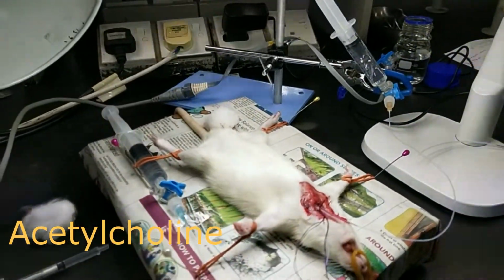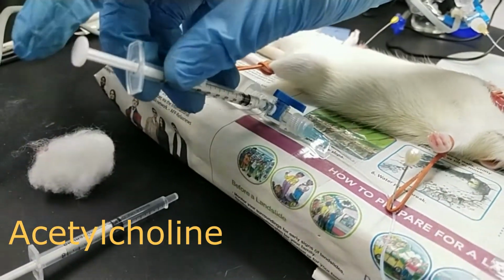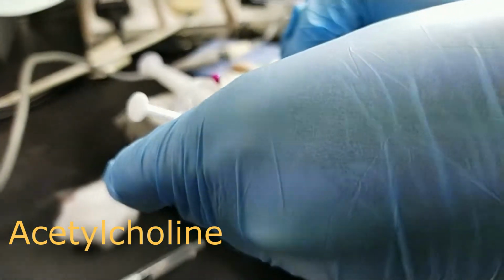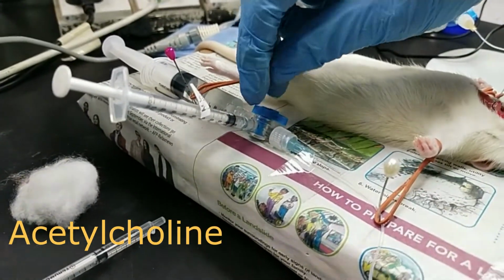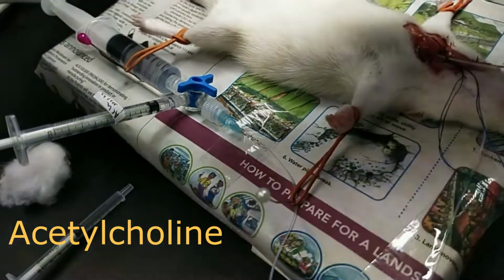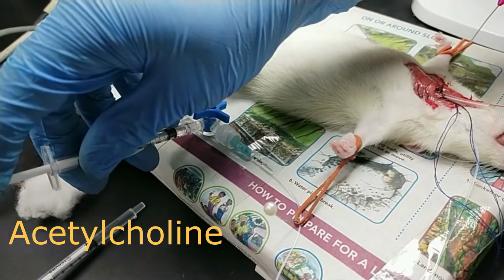What you need to do is introduce the drug through the jugular vein. So we're going to insert the syringe into the T valve. Here we have a T valve, and make sure that it is inserted correctly, and the placement of the T valve here should be correct as well. Whenever you are ready, then you can pump the drug in from the syringe.